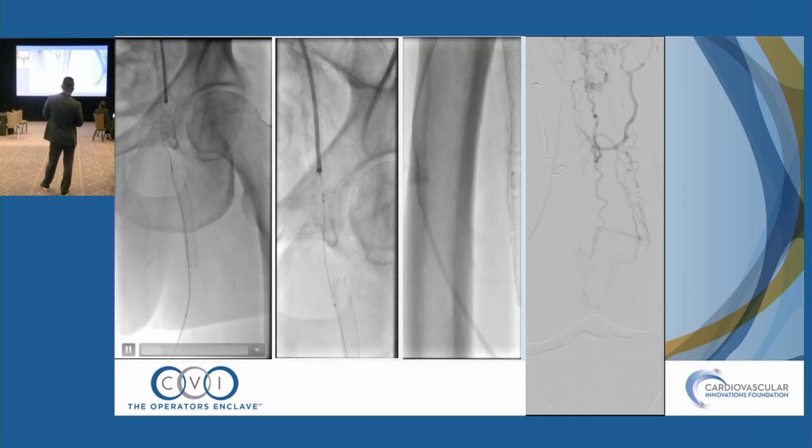Now here, I ended up hitting another serial occlusion. Okay, here's where it reconstitutes. Sorry, it's not playing, but it reconstitutes here. So now I have to cross that, okay? The stent fracture, the stent actually ends right here. It reconstitutes literally right here. So I'm at the end of the stent. This is where the stent fracture is the worst.